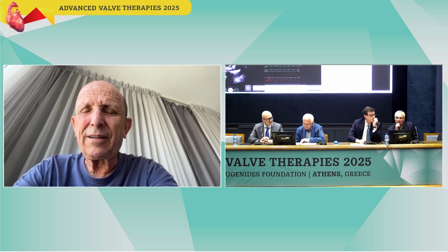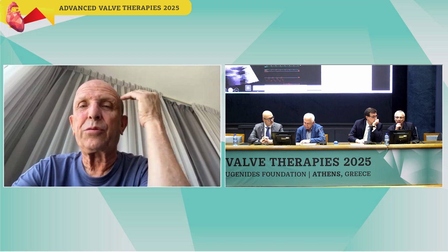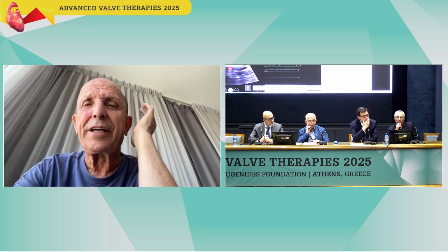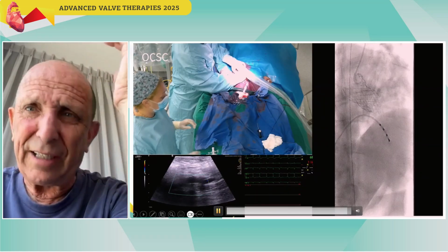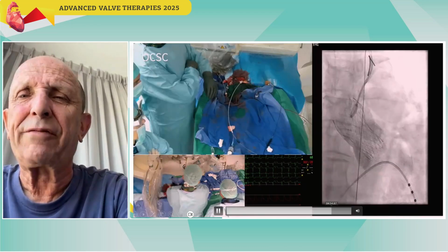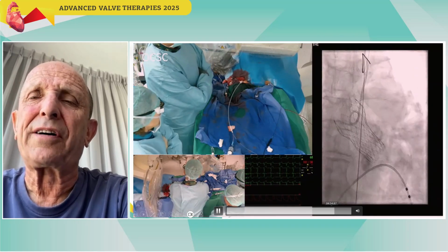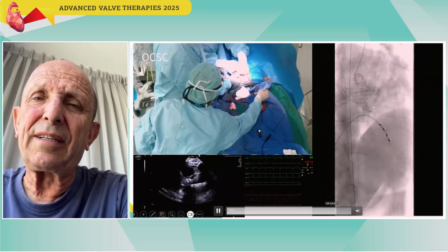Yes, that's right. Okay, so it's a very nice implantation. You cannot argue with success. However, there is something that you both mentioned and I slightly disagree. Nobody can accuse me of not being a fan of the CoreValve family, the Evolut, etc. But the excuse that bicuspid calcified is not for balloon expandable, I'm like a broken record.